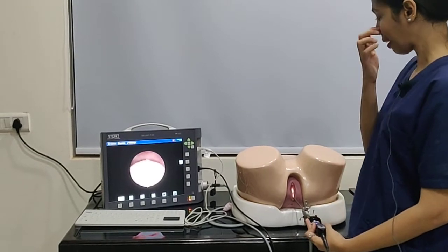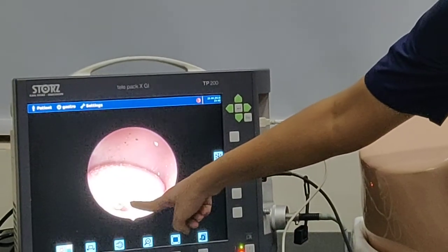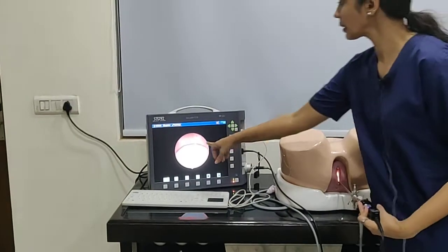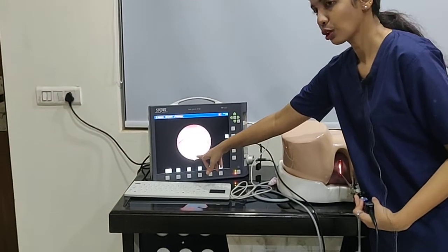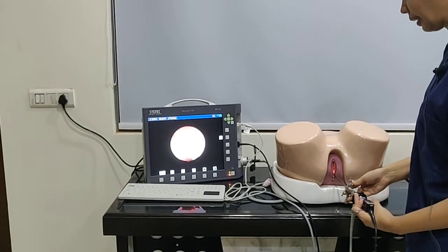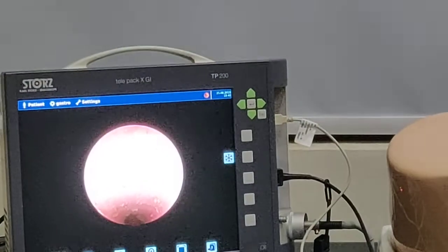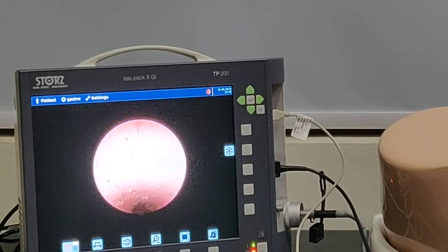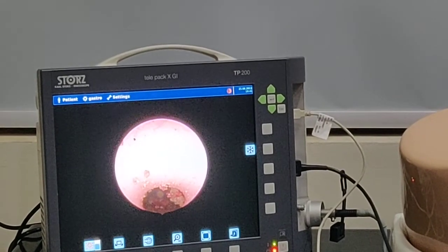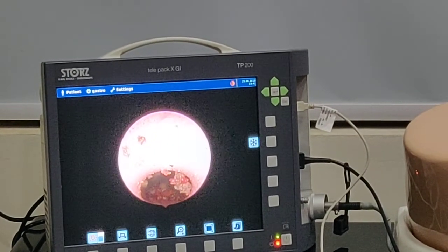Wherever the area we have to reach — we know the external os lies here. When the light cable is down, this area should correspond to the 6 o'clock angle. So as we take it at the 6 o'clock angle, we have reached inside the cervical canal. Once inside the cervical canal, we inspect it and keep on moving further. With the help of the fluid, the cervical canal also distends and we can see more easily.